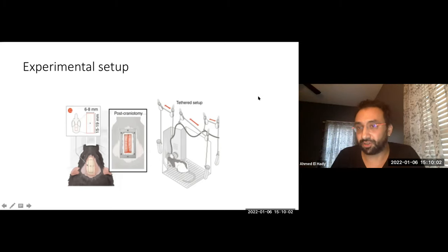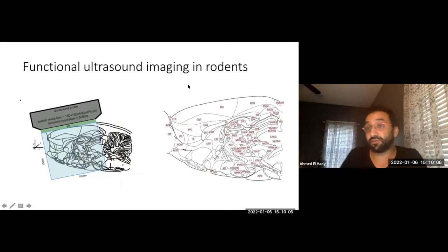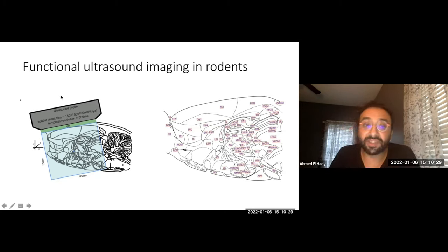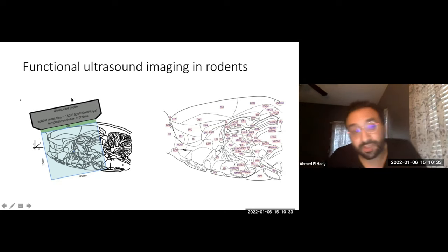So the next question: where to image? Again, I did some literature research, and the advantage of evidence accumulation is that a lot has been studied in single areas or multiple areas, which can guide us. I chose a sagittal plane, 1 millimeter lateral, that allows me to catch more than 53 brain areas. Using the same ultrasound probes that I used with marmoset monkeys, I was able to image at a depth of 15 millimeters and anterior-posterior 16 millimeters. 15 millimeters is basically the whole depth of the brain, so we can even see the neck arteries of the rat if we image deeply. This is very lucrative: I have all these brain areas simultaneously imaged.